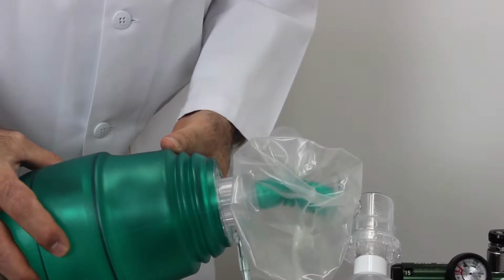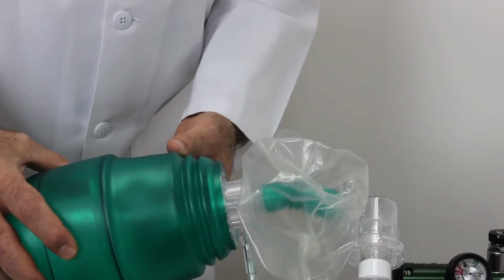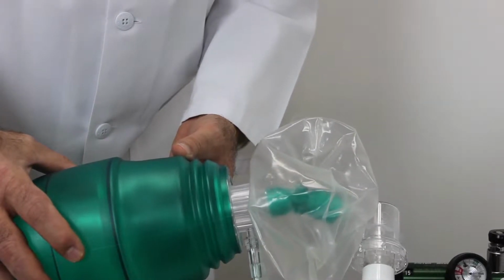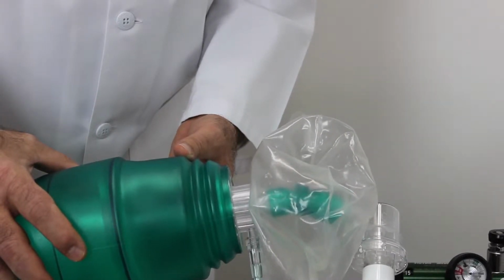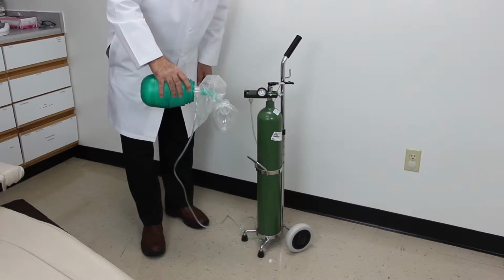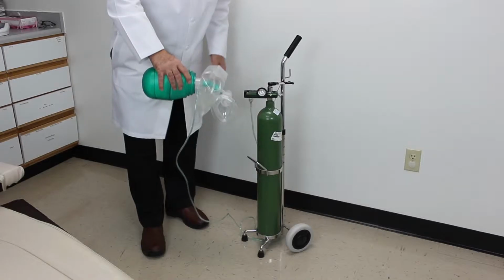In this case, I have a bag valve mask, and you can see the oxygen filling the reservoir. If you are using a nasal cannula or other device, put it up to your face to be sure that oxygen is flowing freely before placing it on the patient.